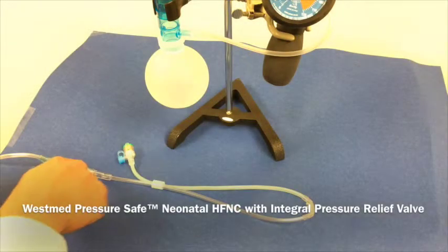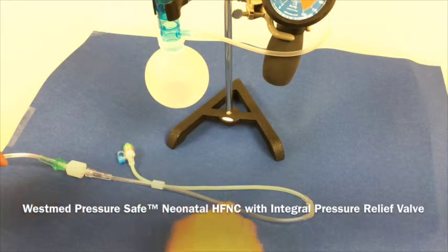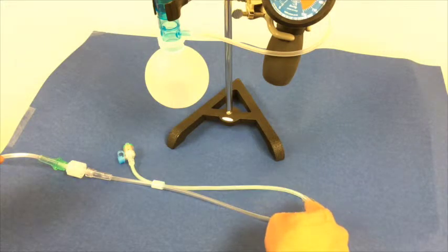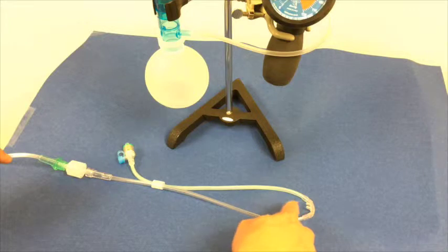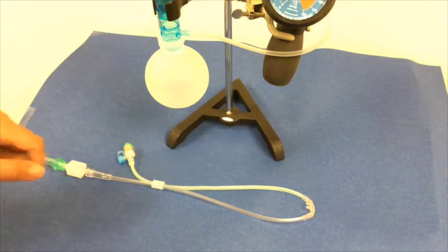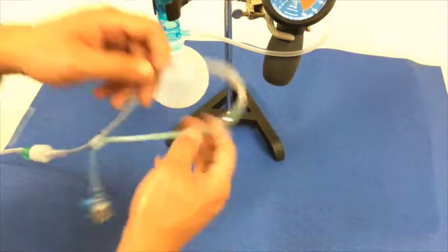This is the pressure safe high flow nasal cannula, where gas is injected at one side of the cannula into the prong, and any excess pressure that may potentially build up will be diverted into the pressure pop-off valve.